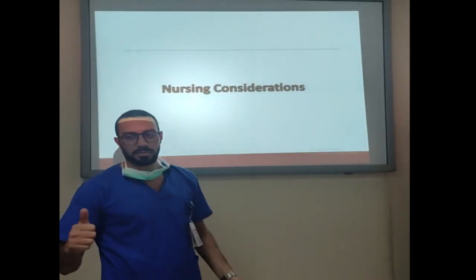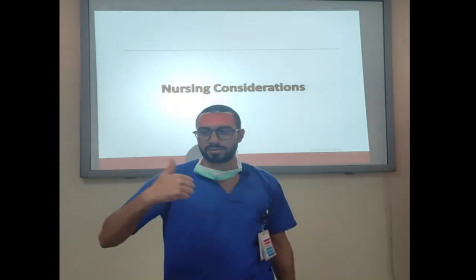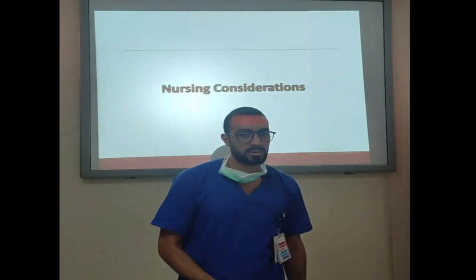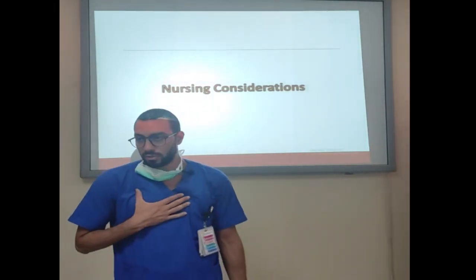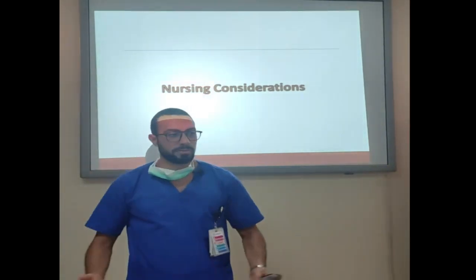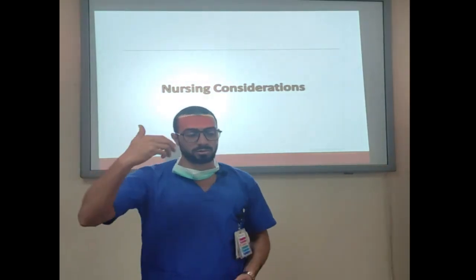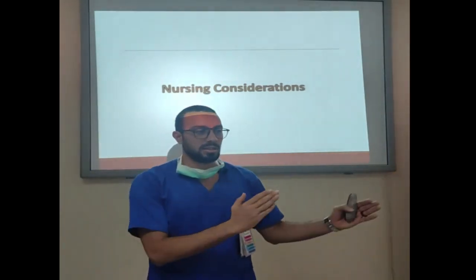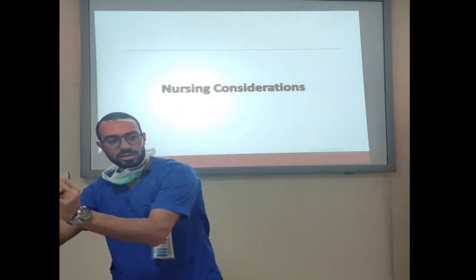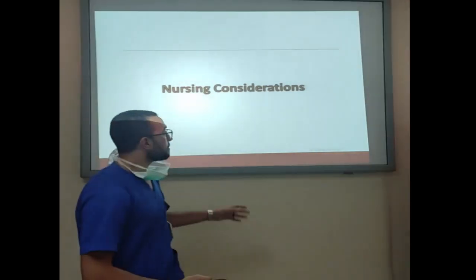So the weaning now: the airway, we don't have a problem with the airway. The patient can cough, he's cooperative and alert, he can protect his airway. Then the breathing, the patient can have effort breathing, and at the end gas exchange, you can measure it with the many parameters of the ABG: PaO2 more than 60, the CO2 not more than 50, while you are giving FiO2 less than 40 and PEEP 5.